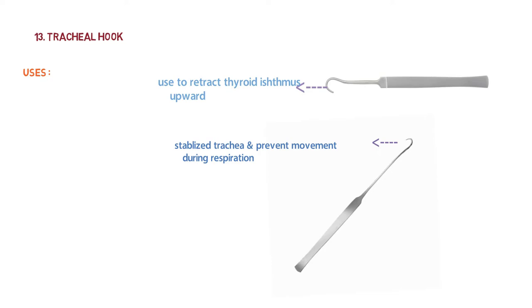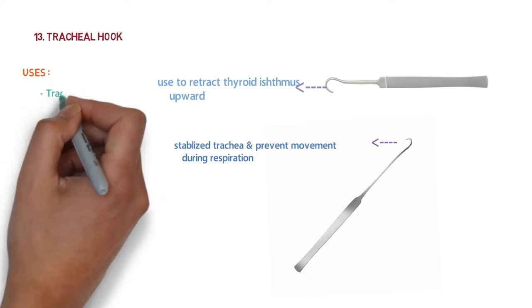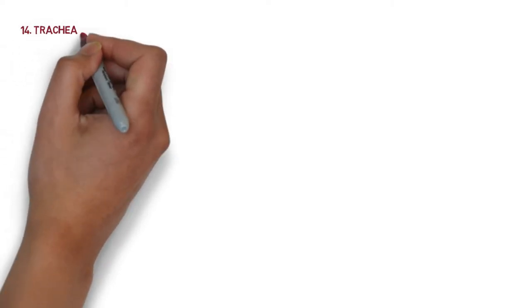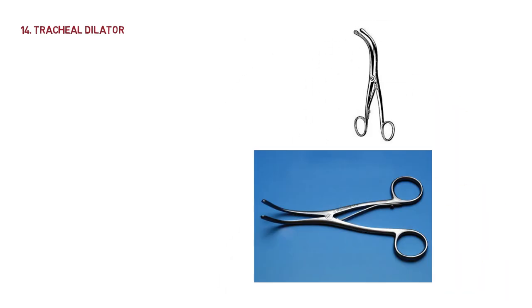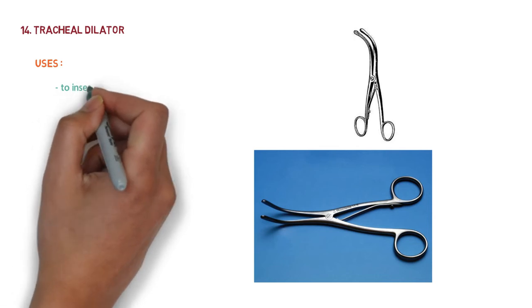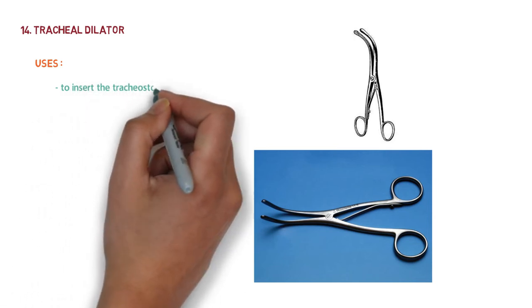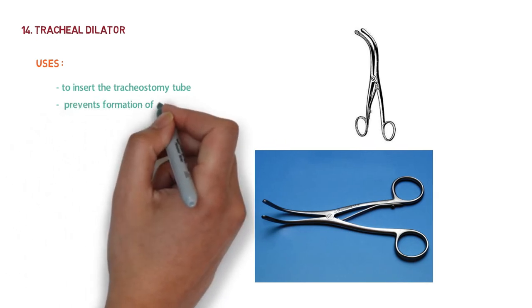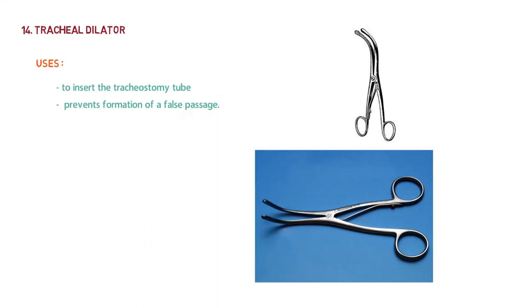Basically, the tracheal hook stabilizes the trachea and prevents movement during respiration so we can easily make the tracheal wall incision. It is used for tracheostomy. The next instrument is the tracheal dilator. It is used to keep the tracheal edges open after the incision so that the tracheostomy tube can be easily inserted, and it is also used to prevent formation of a false passage.